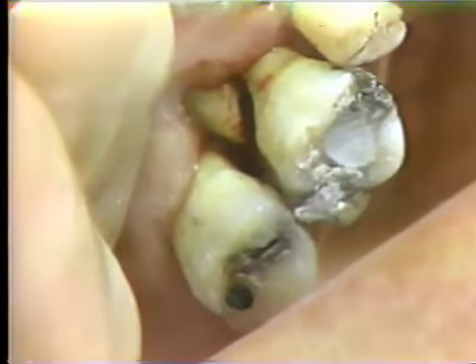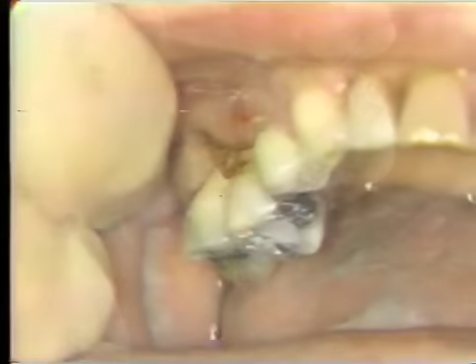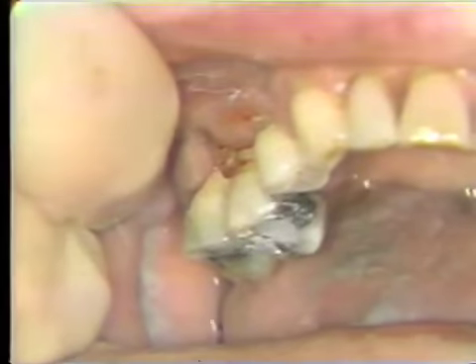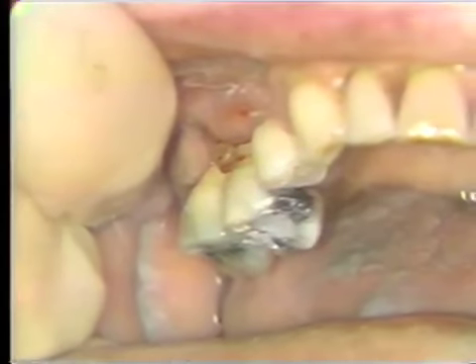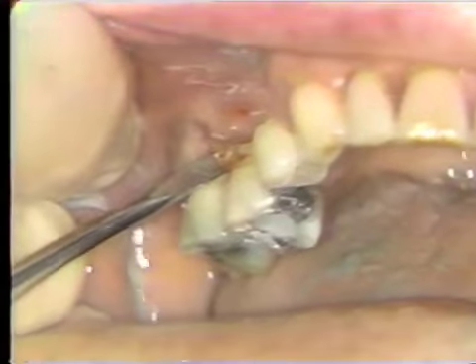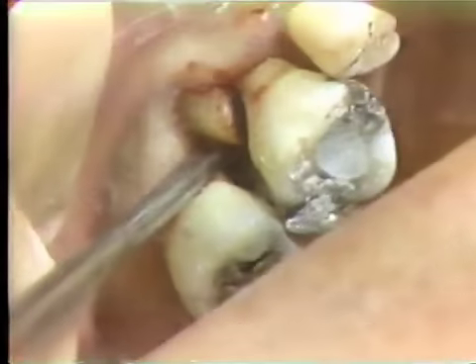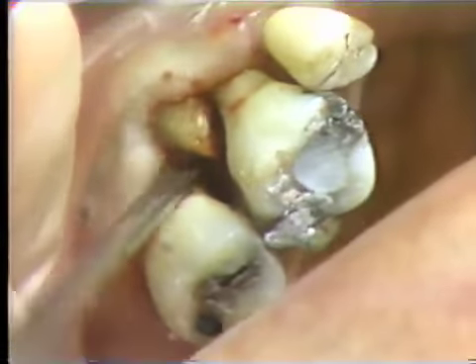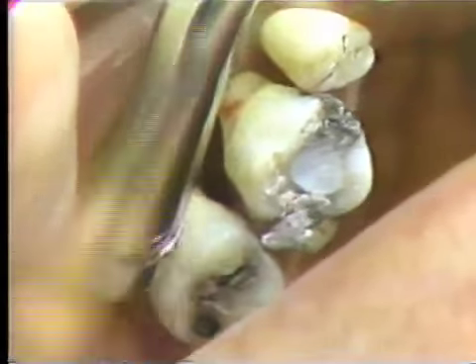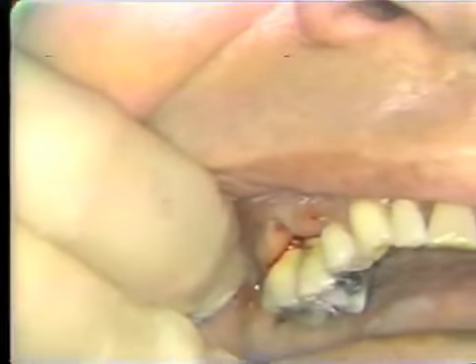Once we are certain that we have cut entirely through the tooth, we will then attempt to deliver the root tip. An elevator was used in this particular case. Pause, please.